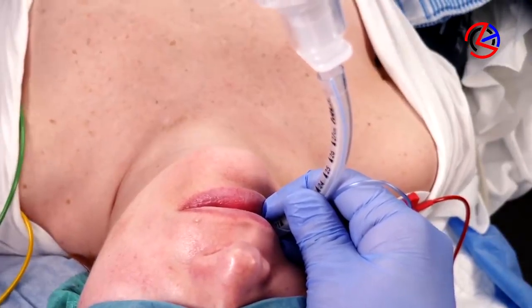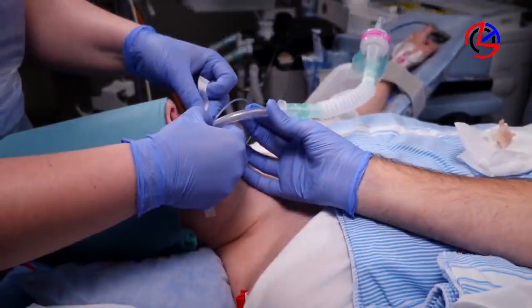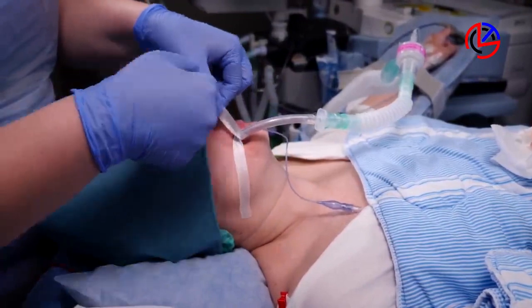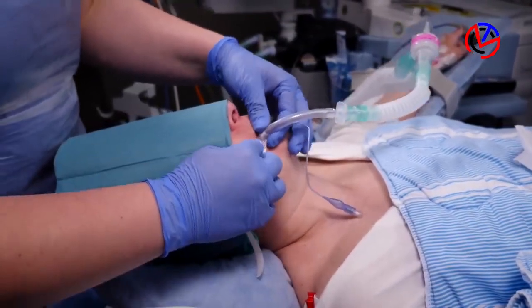When you are absolutely certain that the tube is in the trachea, secure it with tape and initiate mechanical ventilation. Congratulations, you have now performed an endotracheal intubation.